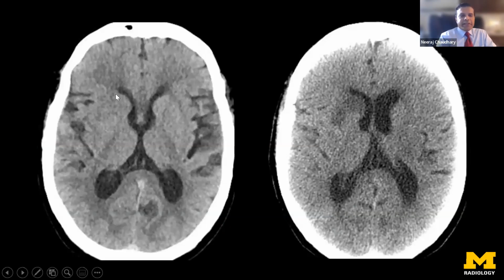So we basically arrested the core tissue that had been damaged up to the point of time that the patient presented to us with these symptoms. As we see on the follow-up CT scan, the caudate head, lentiform nucleus, lateral aspect is what has died. Basically, this low attenuation suggests that the core tissue has succumbed. It is replaced with gliosis, a fluid-filled structure later on. As it matures, it'll be just fluid. And this tells you that the rest of the brain is all salvaged. The penumbra that was hugely green, as we saw on the perfusion study, a large area, has been salvaged. And the patient did excellent from an outcome point of view.